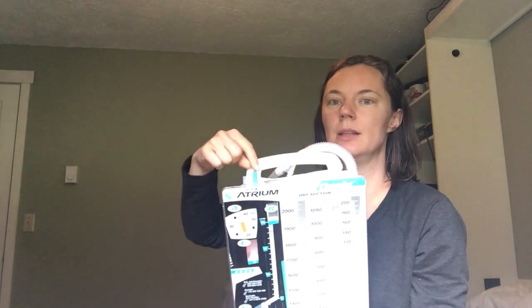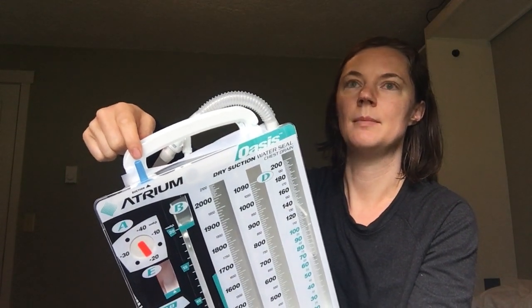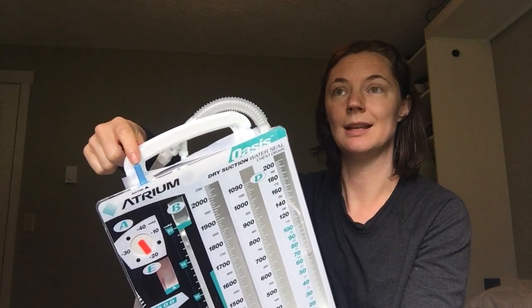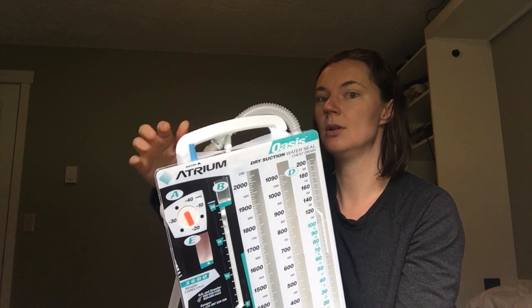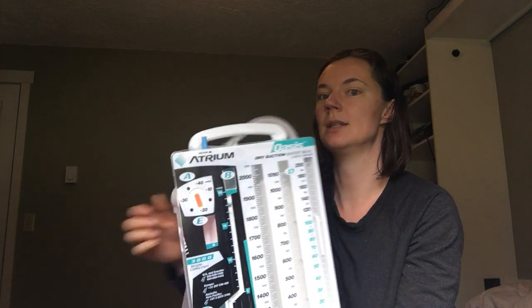And then you need to plug this top blue right here into the suction canister into the wall. And that needs to be turned to low suction, at like 70. It says on this tube if you're ever unsure. But just low suction, not high, not medium, just low suction, and then plug it into here, and then you'll see when it's plugged in that this accordion will come out, and that tells you that the suction's plugged in. The orders can be kind of tricky. A lot of times the orders will say -20 H2O, that means suction. That -20 anything, the H2O does not mean water seal.